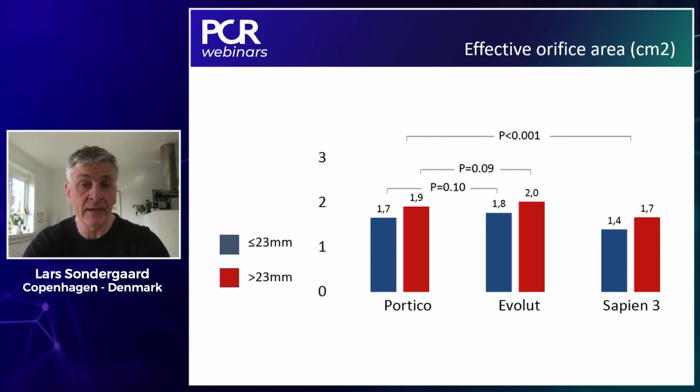Yeah. And that was actually also what our discussion here in Copenhagen, that there were two factors. The patient was pretty young and could go for surgery, but there were two things which made the decision for TAVI. First of all, the risk of PPM, and also the patient preference. She wants to have TAVI. She was not very keen to have surgery. So if you can just get the slide up again, we can show what kind of valve was chosen here. We chose the next generation Portico valve, what's called now the Navitor valve.